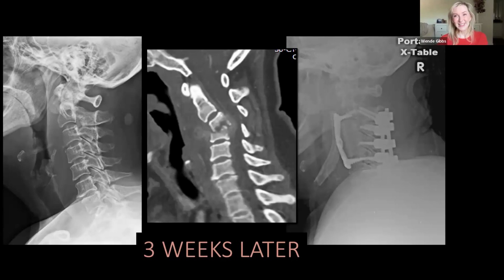And for any other surgeons listening, don't order a CTA though. I mean, you can order a CTA, but it is best seen if they do the regular CT with contrast of the neck because of timing issues, because the contrast fills the vessels but doesn't always fill the soft tissues at that time of imaging for a CTA. But both will work, especially if the timing's wrong. Anyway, order the CT, but either one will work.